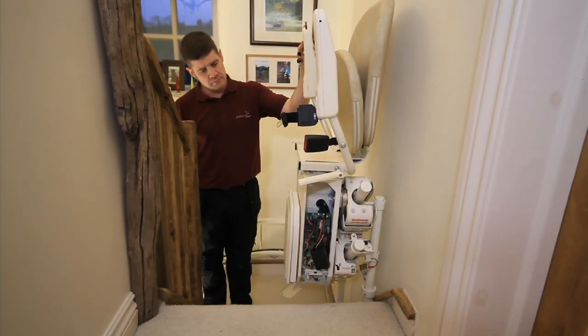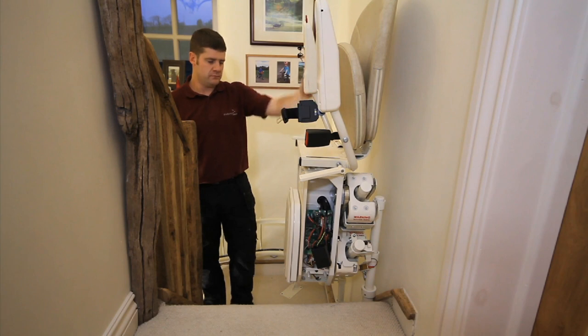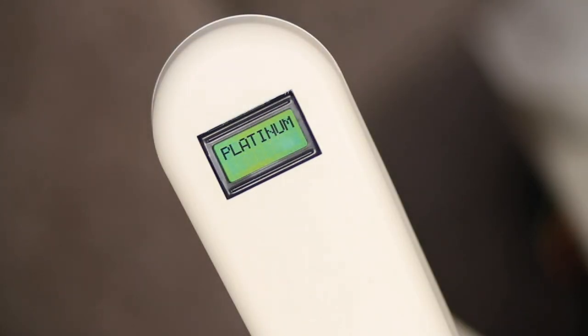Finally, run the carriage all the way to the top end stop and check that the display goes onto charge. The carriage is now fully programmed.